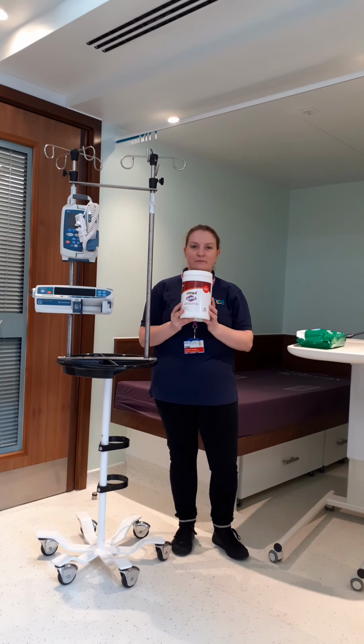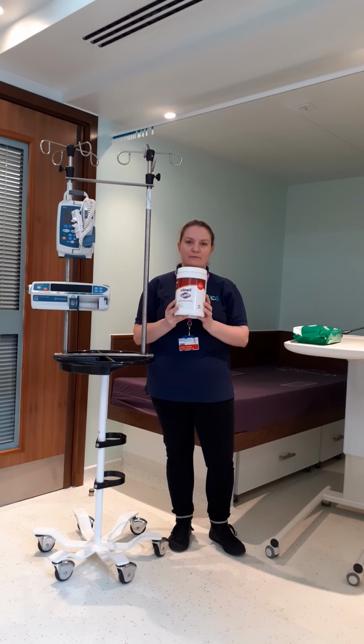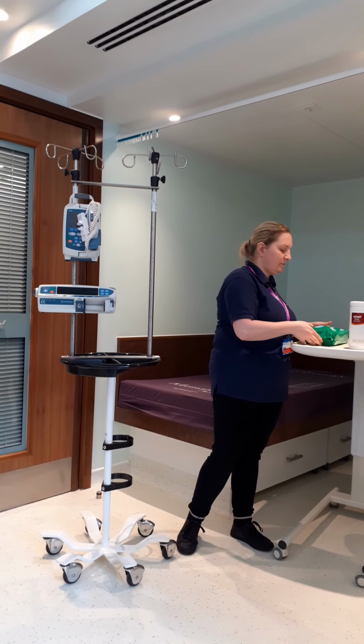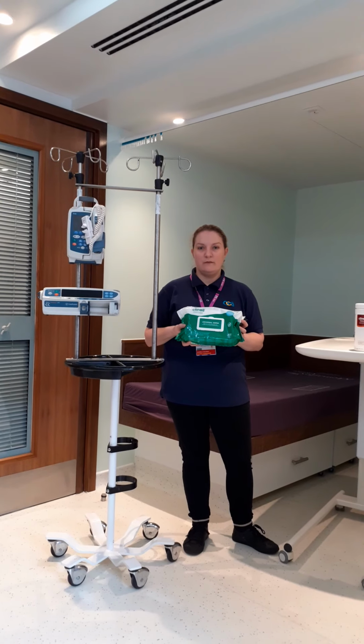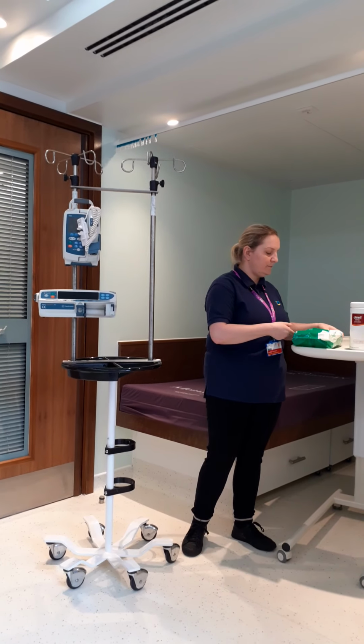If you're asked to do this, you'll also be given advice about what protective equipment you might need to wear in order to protect your clothing and other items. But for today, we're going to use the green Clinell wipe. So, step 1, choose your wipe. We've chosen the green Clinell.